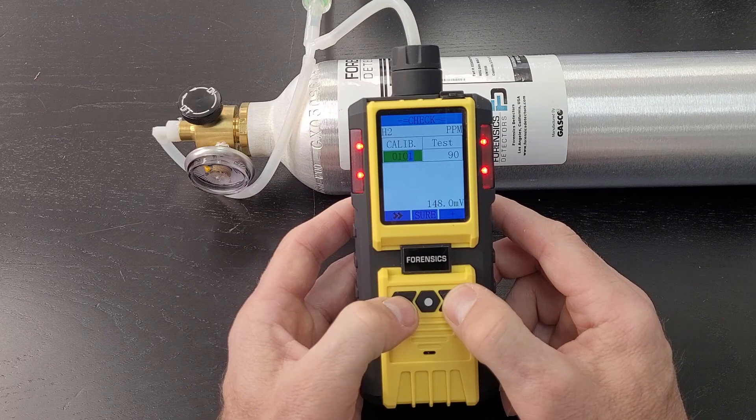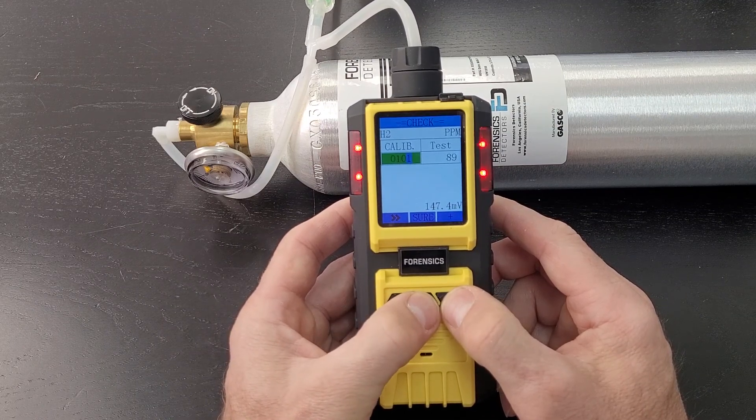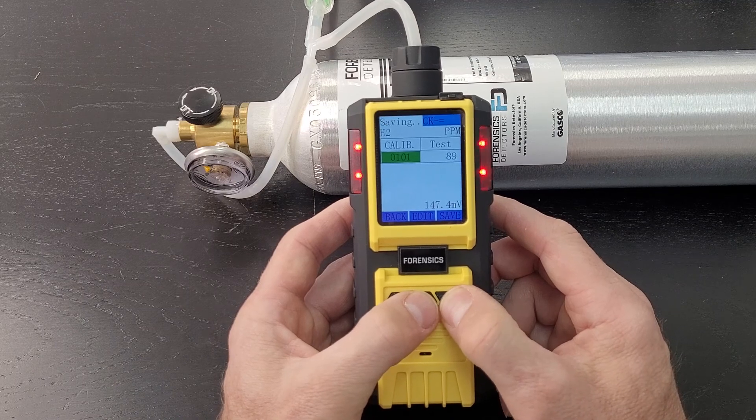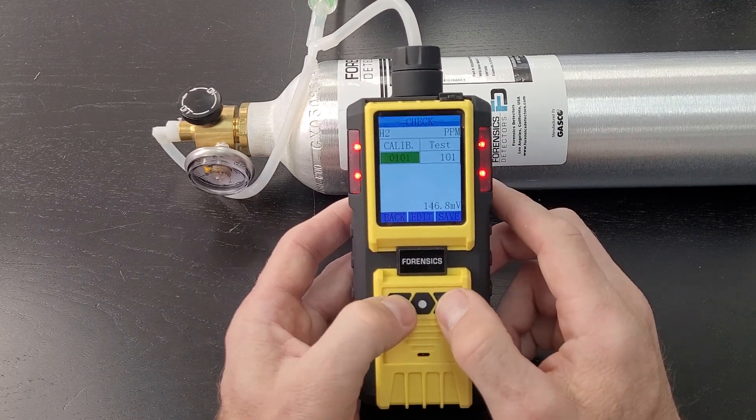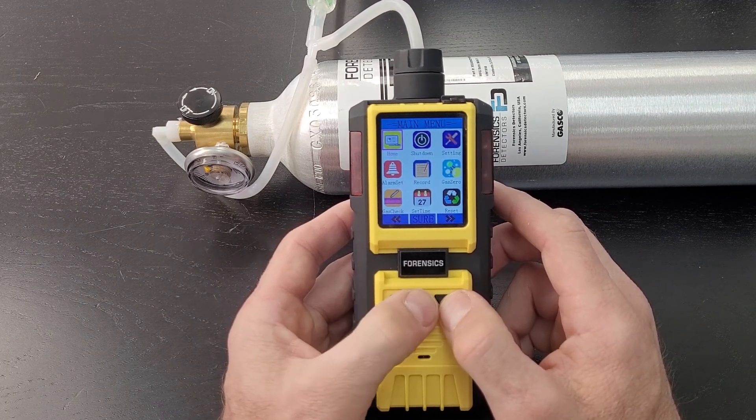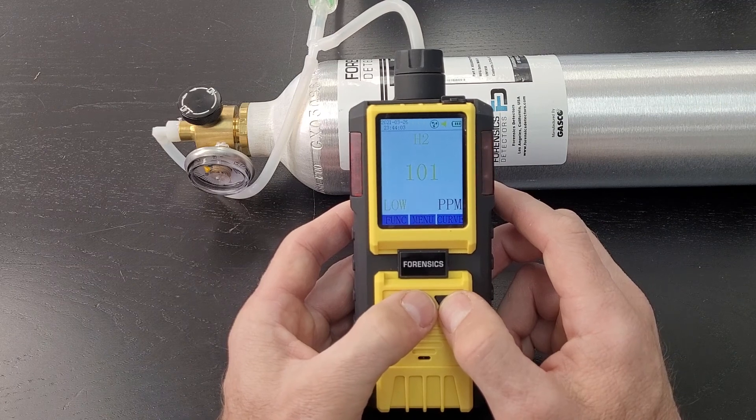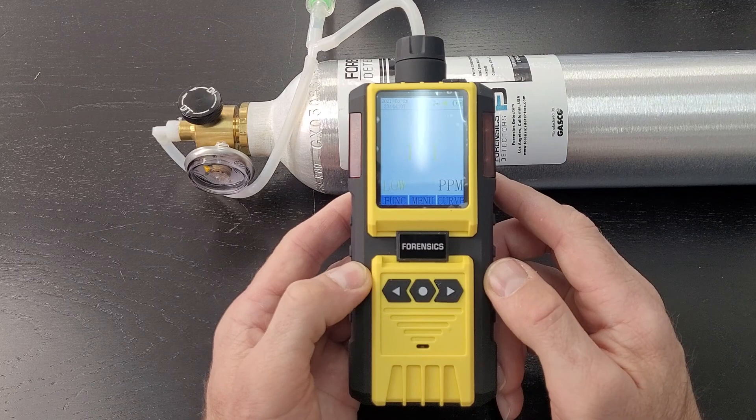Press edit, go across, change the digits to the concentration of your gas. In this case, as you well know, it's 101. Let's keep going across, press sure, save - it is done. You can see that we go back to the main menu, and it's going to be 101 or hovering around there. There you see it. Congratulations, you have calibrated your gas analyzer Model 600.